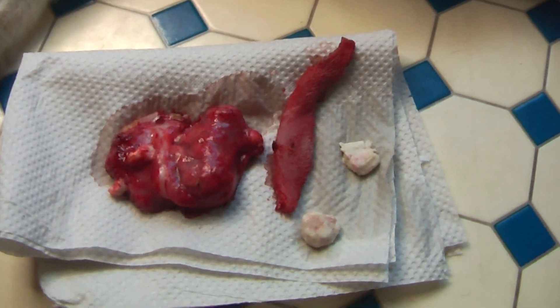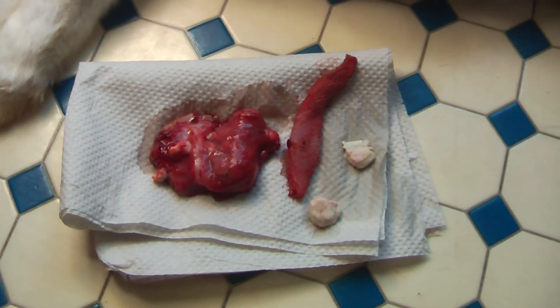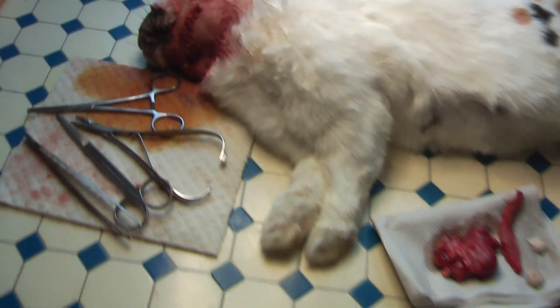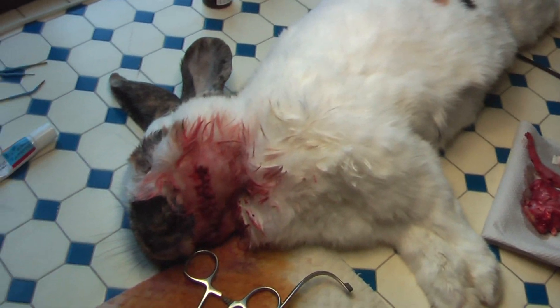Abscesses in rabbits are filled with this kind of pus — it looks like cheese. This is a bit of skin that I had to remove. The abscess was very big, so I had to remove some skin — it was too much. The rabbit will need some antibiotics now, and a painkiller, and then it will wake up in a while.